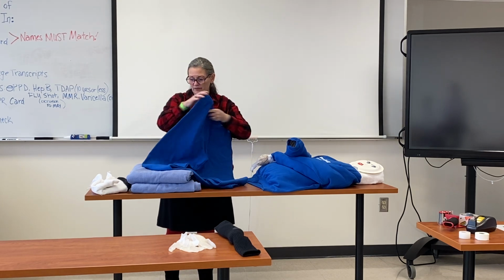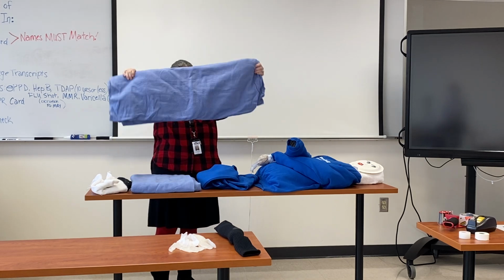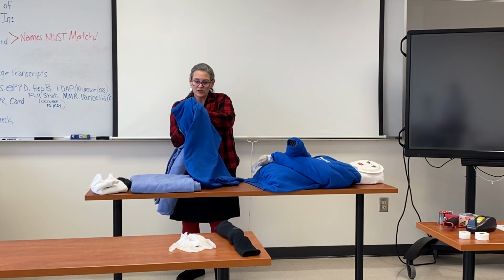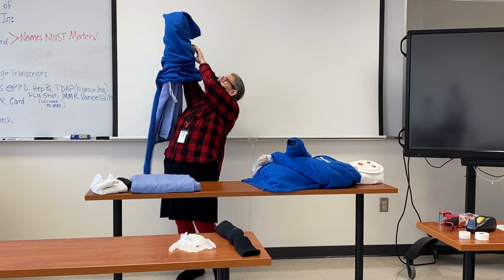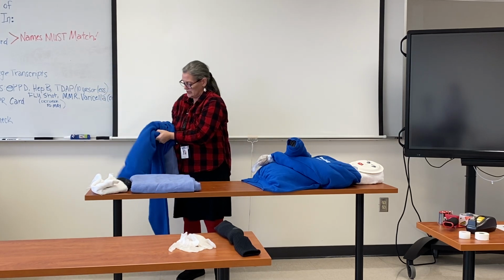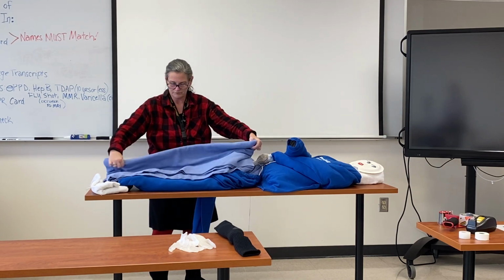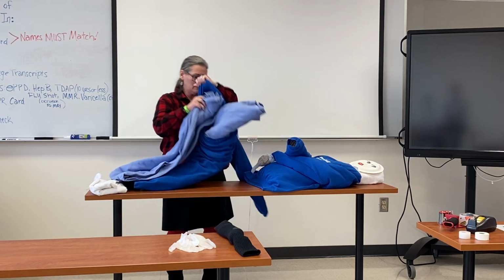To make legs, two blankets that you're not using. Again, just fold them so that you can get some length out of them. And then just like with Granny's arms, you're gonna stuff the legs. Granny's gonna take on a very lifelike quality here very quickly. Here's Granny's other leg.